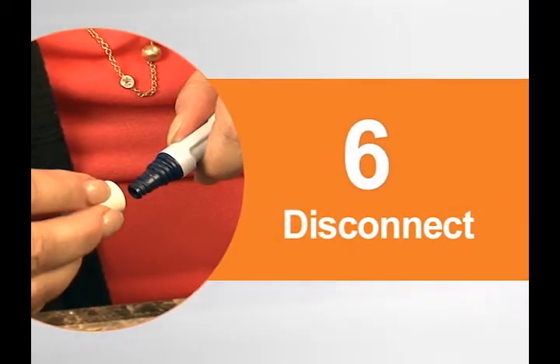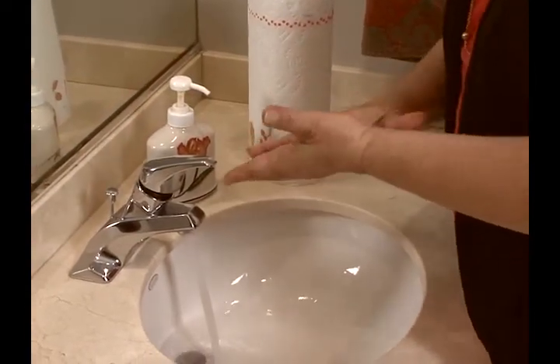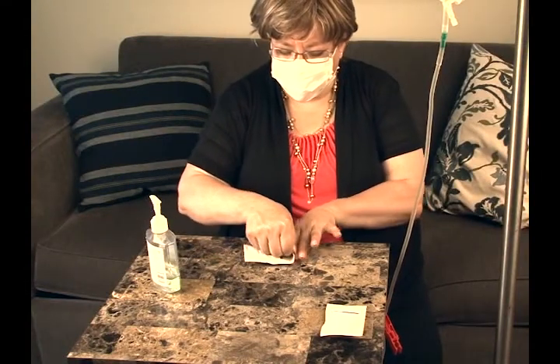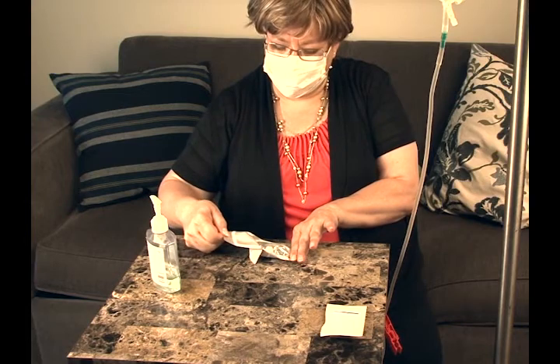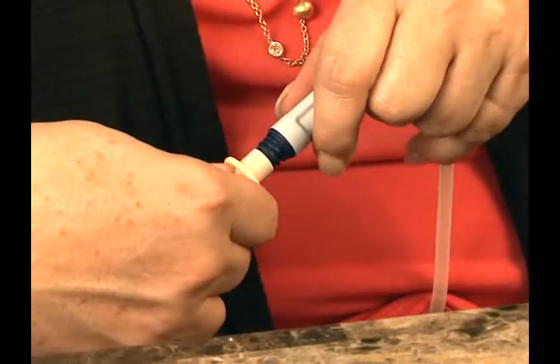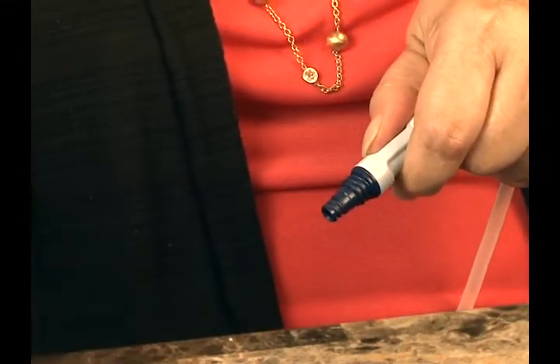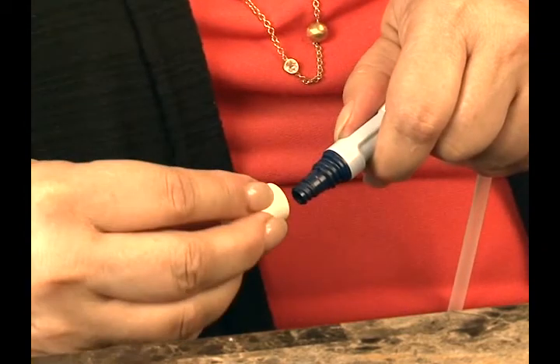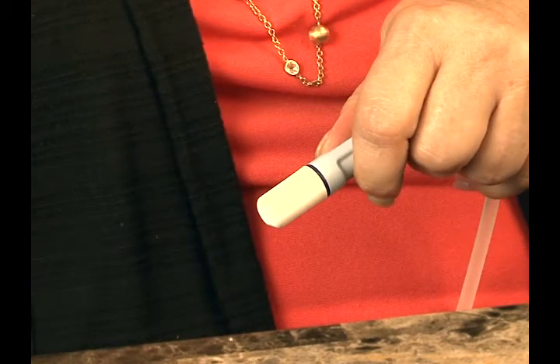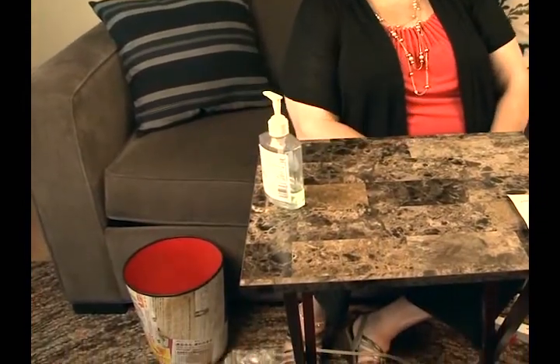Finally, let's look at how to disconnect from the UltraBag system. First, re-mask and wash and dry your hands thoroughly. Open the MiniCap disconnect cap package and look at the sponge in the cap to make sure it is wet with betadine. Be careful not to touch the sterile sponge. Disconnect the UltraBag system from the transfer set by twisting the patient connector. With the transfer set pointing down, hold the MiniCap disconnect cap up and immediately twist it onto the transfer set until it is firmly secured. Finally, dispose of the used supplies as instructed by your dialysis clinic.